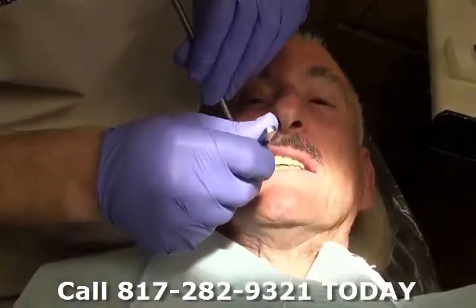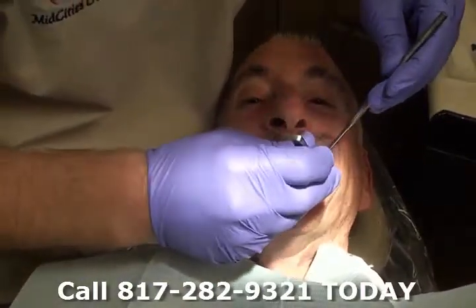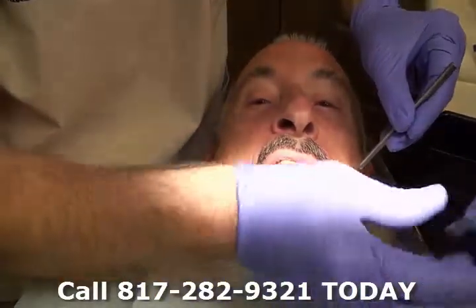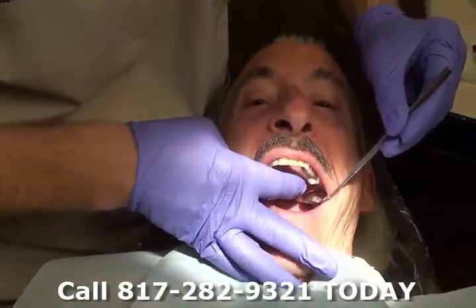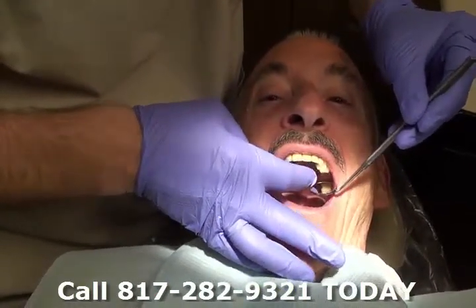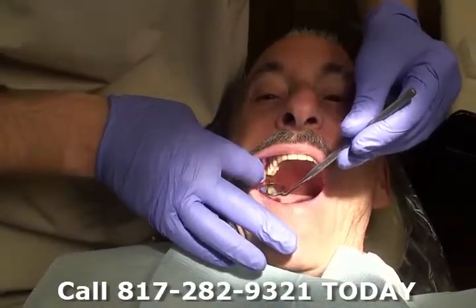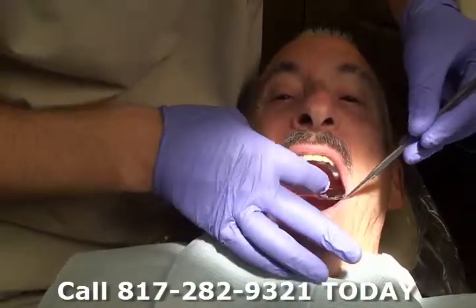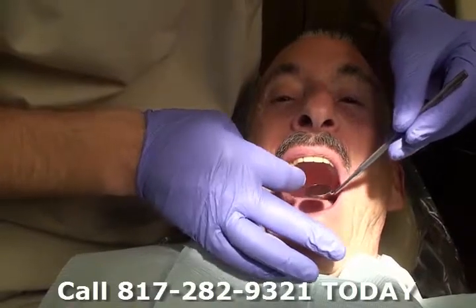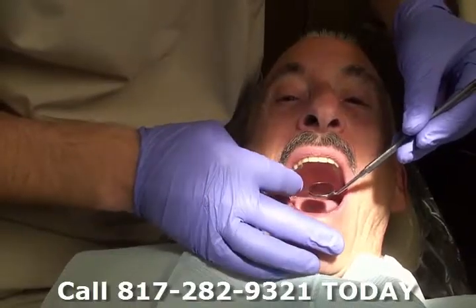Bite together and hold. Open. Bite together and hold. It probably hits the very back. So what we do, Ralph, is we use that articulating paper — the blue stuff. It tells me where your bridge hits. The idea is to make it look even and feel even all the way across. You can see it is hitting both sides, but a couple spots are maybe heavier than others. So I'll adjust a couple minor spots and see if that equilibrates it where it's comfortable to you.